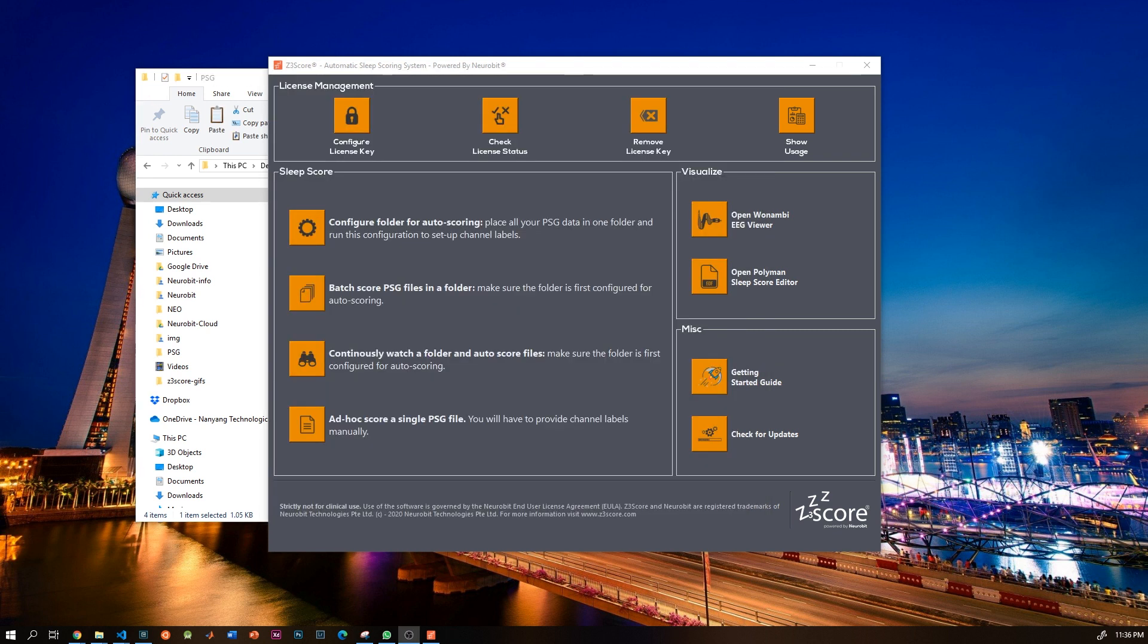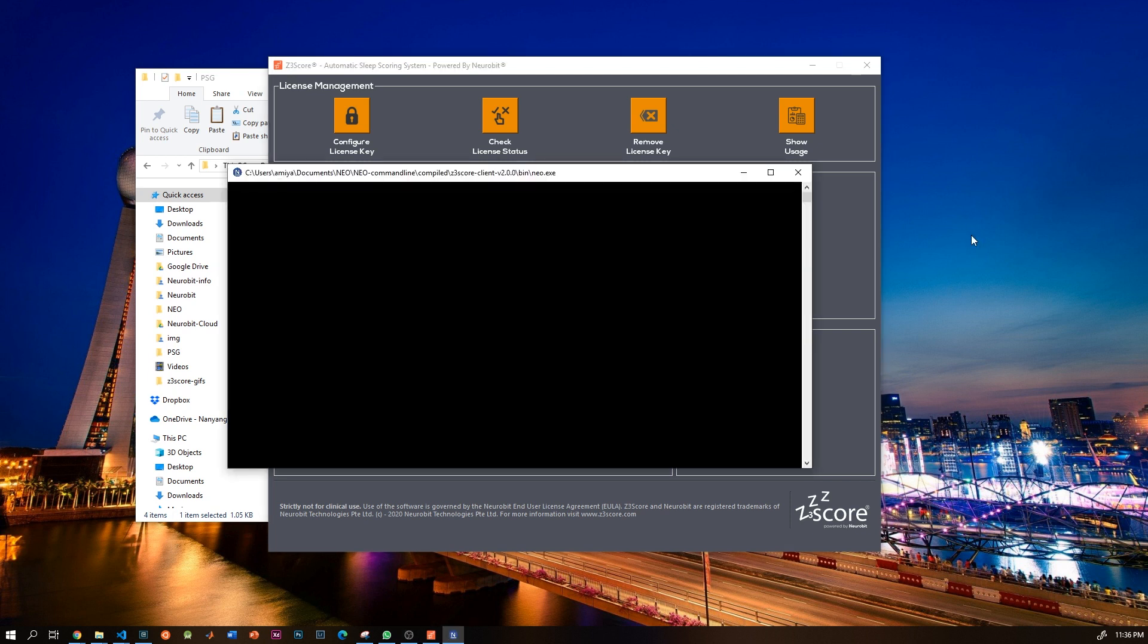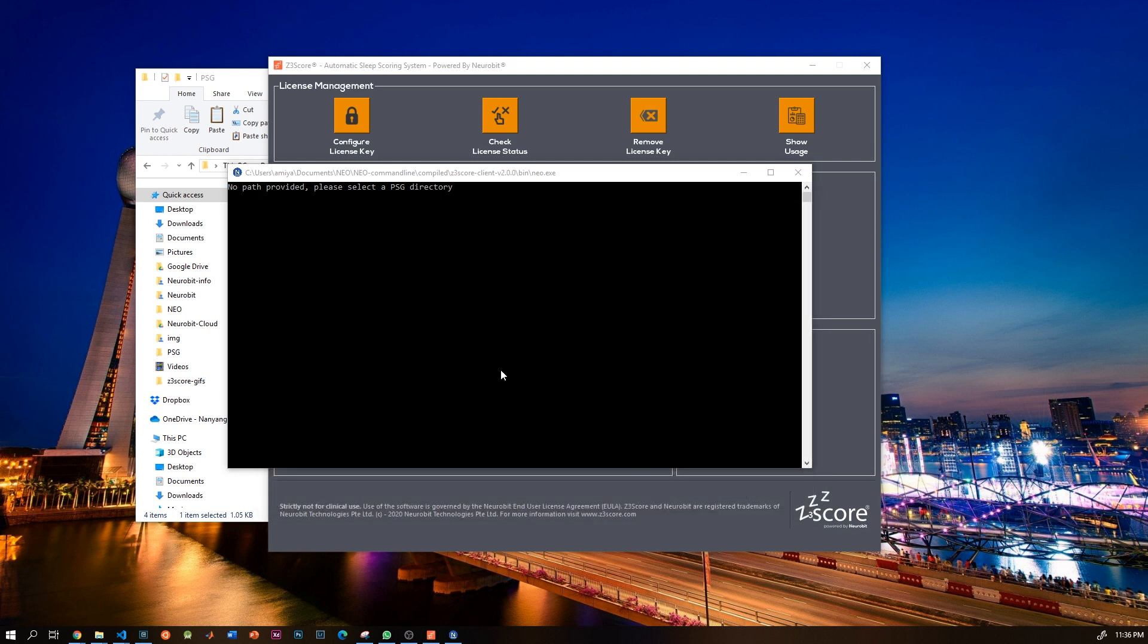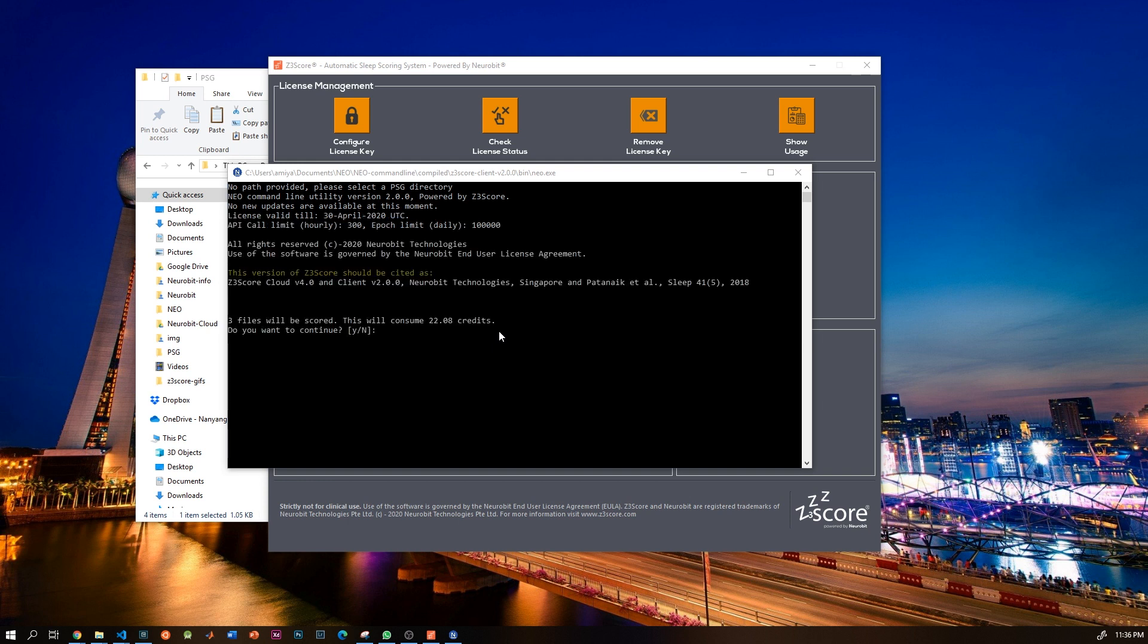Let's do batch scoring for all the files in the folder. Press batch score EDF files and just select the folder. It reads the channel configuration and all the EDF files. So scoring these files will consume 22.08 credits. If that is okay, say yes. So I'll say yes, and then within minutes all the data is scored.